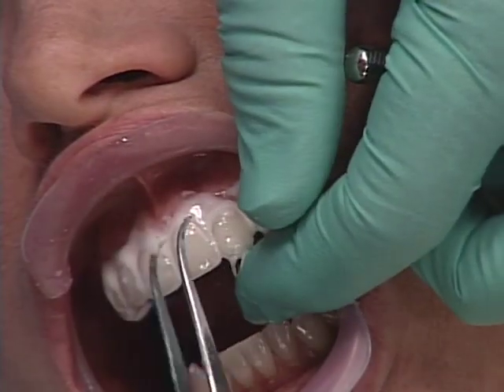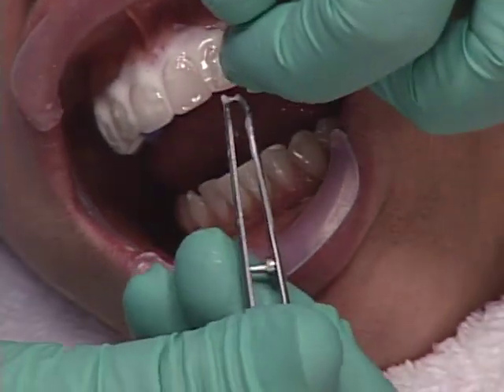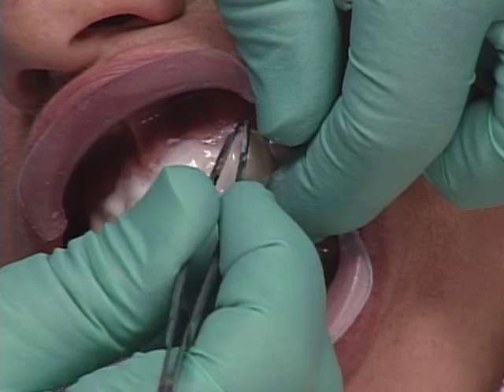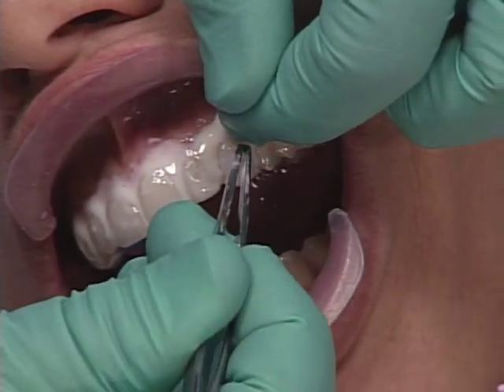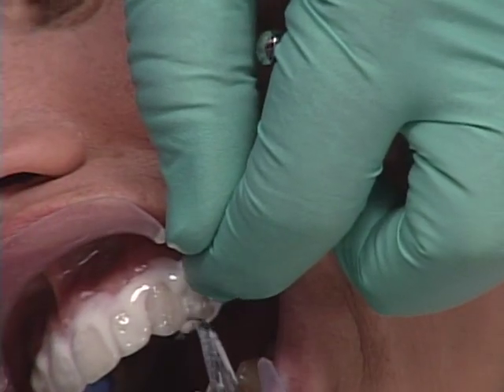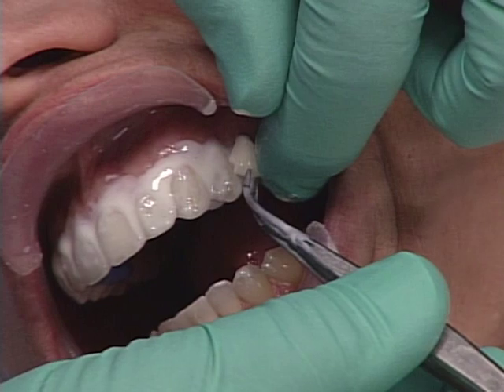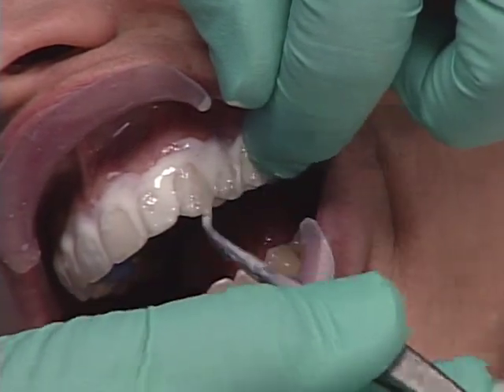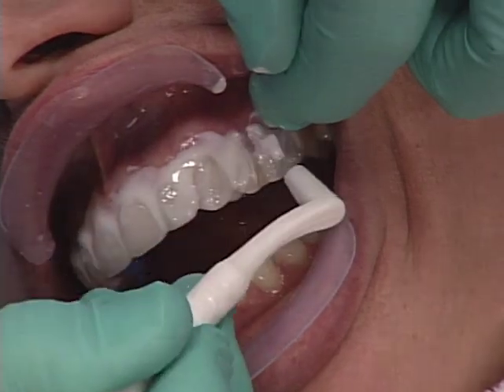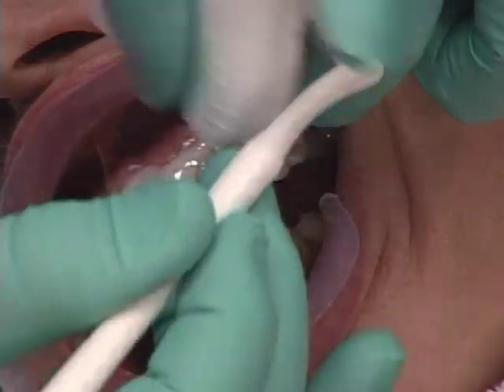Oh, you've got about 10 minutes before things start setting. But if you've got Tenure S on there, you may only have 5 minutes. These all have incisals wrapped over them. And then if I don't want to have them wrapped, I can take them off. I'm not in a hurry, but I'm not wasting any time.